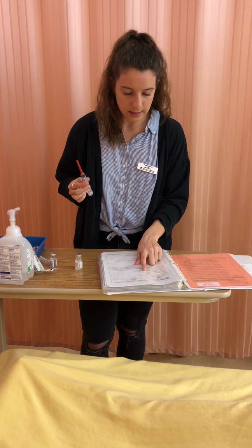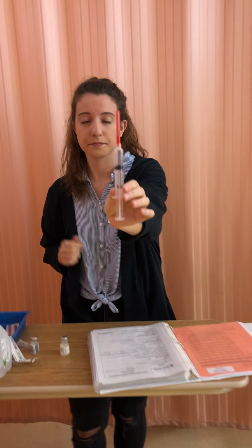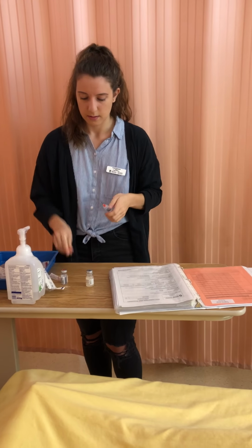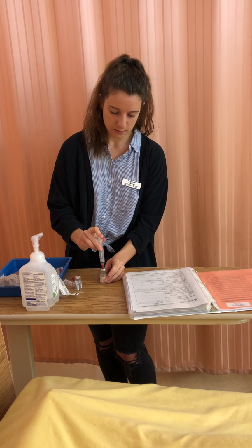So I will be needing 4.8 milliliters of sterile water for my injection. So I will need 4.8 milliliters, or 4.8 milliliters of air. So I have that here. I will inject my air into my vial and draw up that 4.8 milliliters.